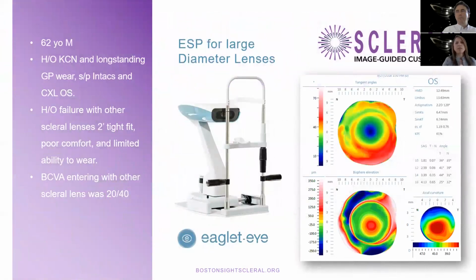So just to end our webinar today, I'm going to take you through two case examples, one representative of each bracket of that complex corneal lens spectrum: one in the irregular cornea space, and one from the ocular surface disease space. This is a 62-year-old male, history of keratoconus, long-standing history of GP wear, and he's doing well actually with his GP in the right eye.